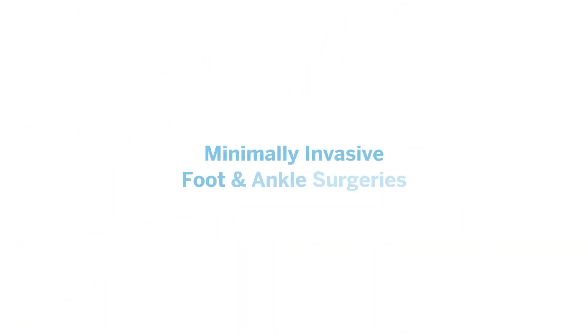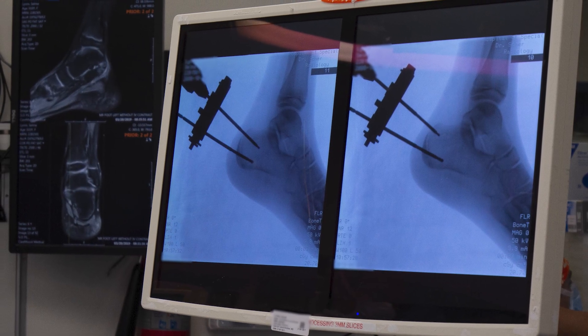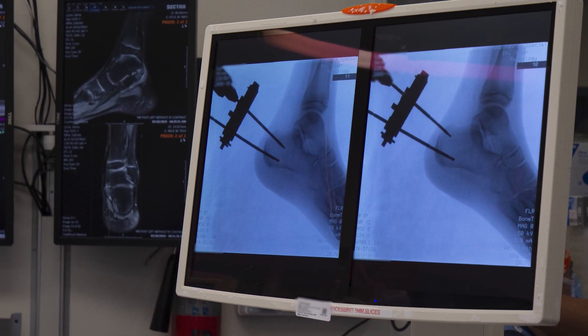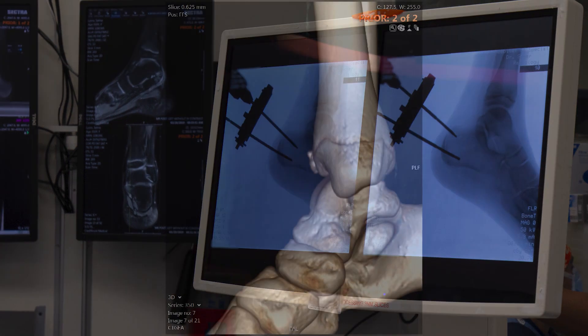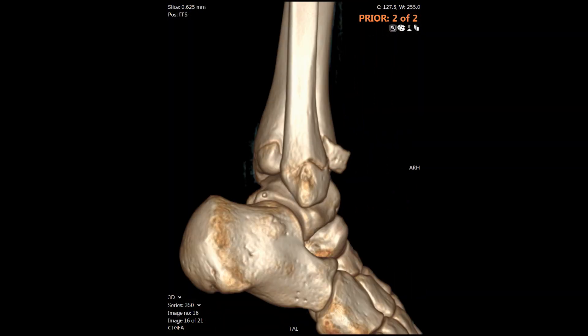Here at HSS we're using surgical navigation and enhanced arthroscopic visualization techniques in order to perform minimally invasive foot and ankle surgery in our pediatric and adolescent patients. In the past several years I've used surgical navigation along with advanced imaging techniques in the operating room to help improve the accuracy of my surgery to excise tarsal coalitions.